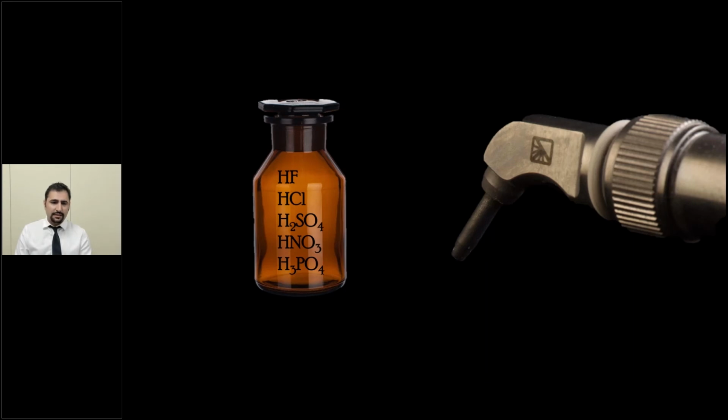These acids are a combination of hydrofluoric acid, hydrochloric acid, sulfuric acid, and other pretty strong acids. So it's not easy to use them without a very confined situation that can suction these acids out, and it's not that easy to create that environment. Then once we have the acid, we need to embed the zirconia crown inside the acid for maybe an hour or 2 hours. After that, we need to glaze the surface of the zirconia again, because essentially we embedded the whole zirconia inside it.